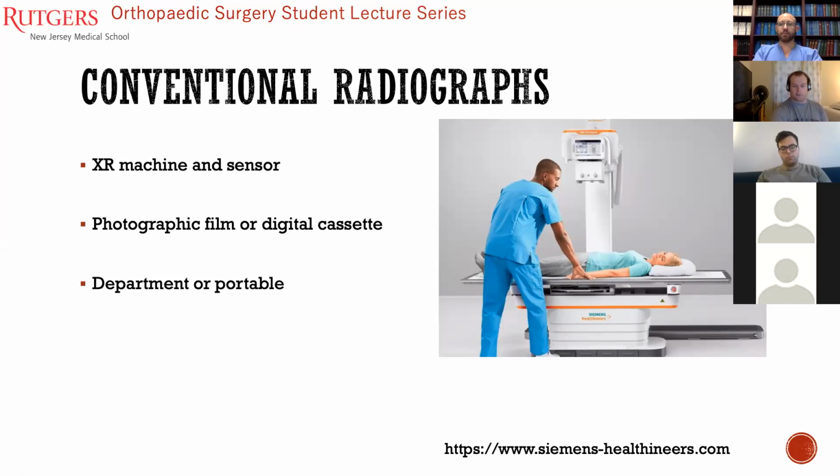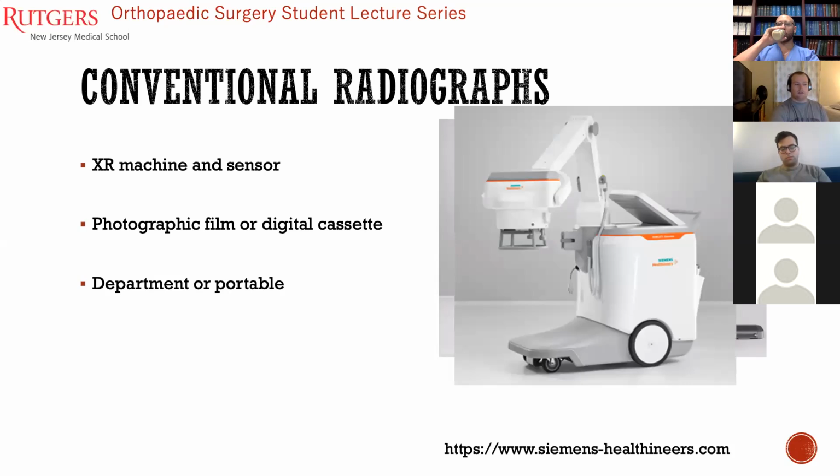The films can be done primarily in the radiology department, where you will have this type of bed set up so patients can be placed in certain positions and moved around. The table moves around easily to X-ray different parts of the body, or you can use portable machines such as this one, where you have to place this individual cassette beneath the patient. But this does help in that it's similar to some of the newer radiology suites and departments. It is digital, where you do see the result of the image immediately, as compared to some of the older digital cassettes that require reading separate from where the patient is.